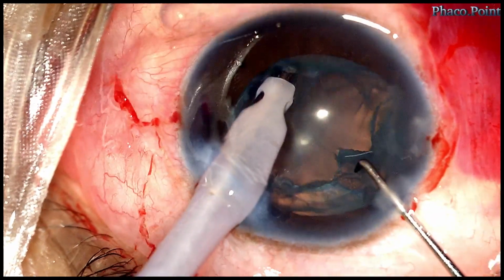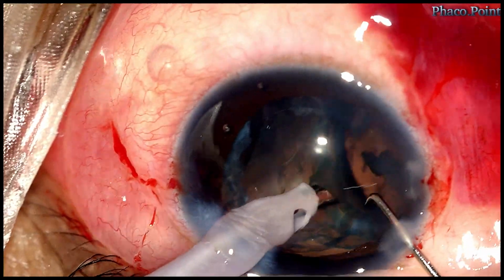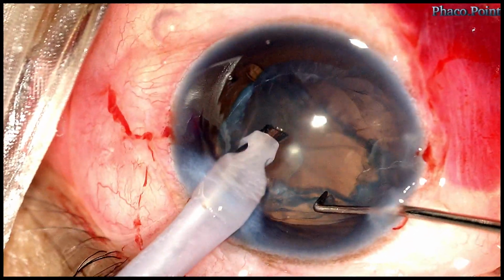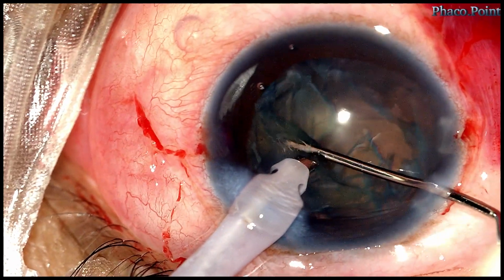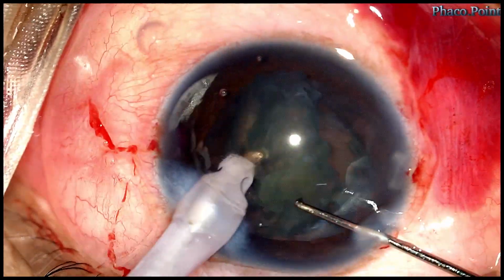In order to do so, I first change my settings to the epinucleus mode and aspirate as much of the epinucleus as I can. I replace the chopper with a dialer and use the Sinskey hook to hook out the subincisional epinucleus out of the capsular bag, after which, as you can see, it is aspirated with significant ease.